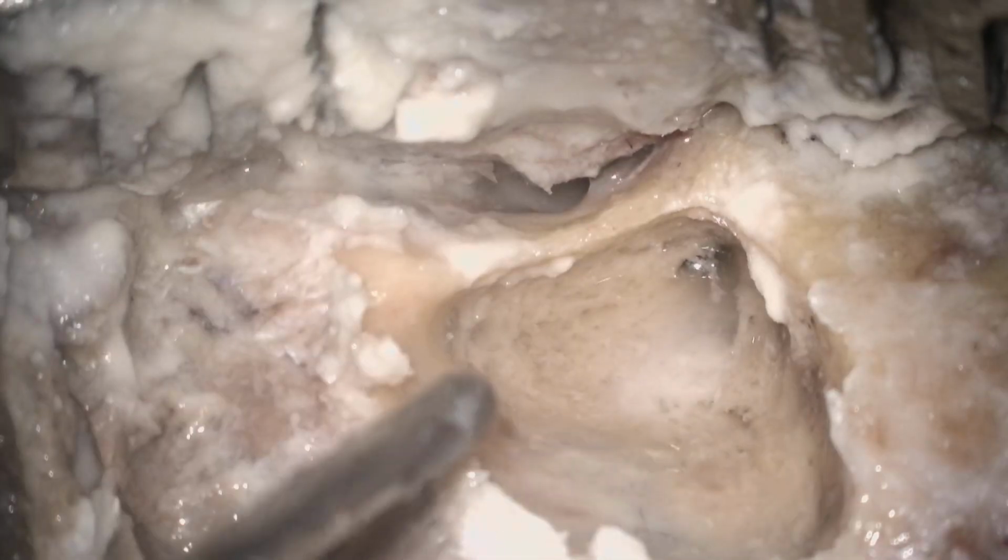Look, this is the lateral tip cell bone, and we are drilling this. Look, there is a jerky movement of the bar. This is why what I am saying at that part: when you touch both the surface of the bar with the bone like that, then there will be some jerky movement.